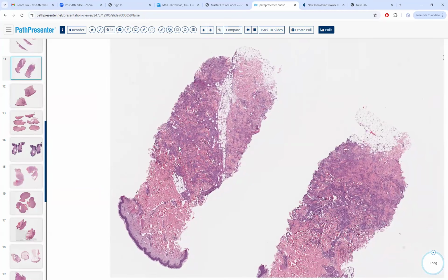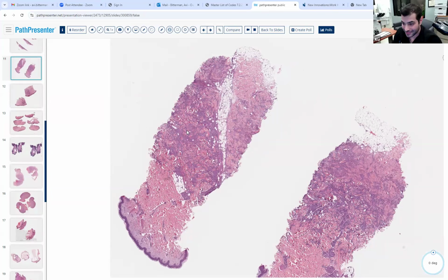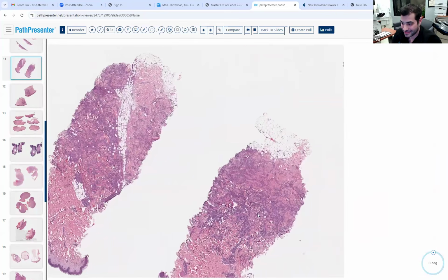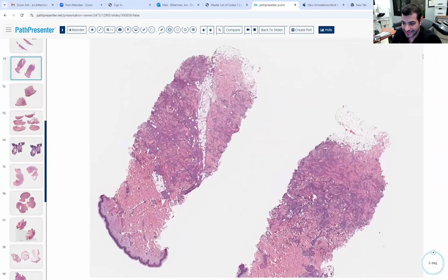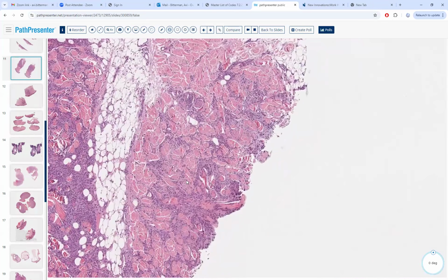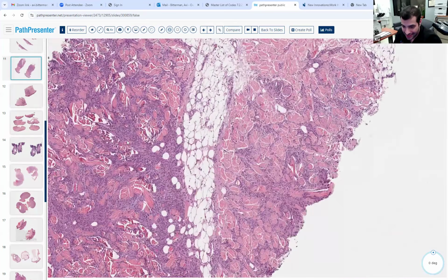Punch, deep histiocytic infiltrate. Where is it? Is it deep, like in the subcutis? It's in the dermis, not all the way in the fat, but in the deeper dermis. Is it a nodule, palisaded? It just looks infiltrating. It doesn't look like a nodule. Yes, it's an interstitial pattern. Okay, good, interstitial.